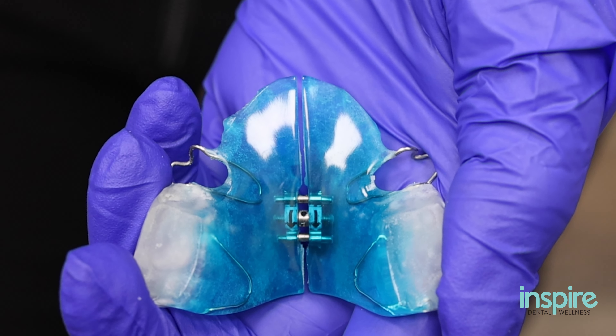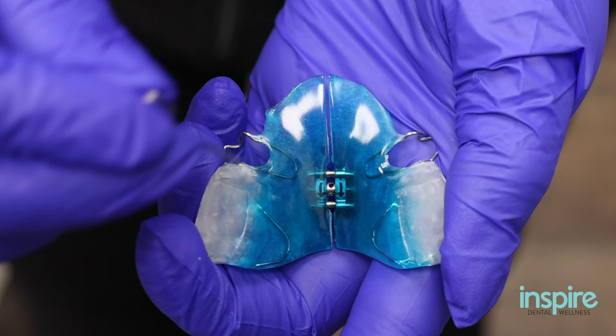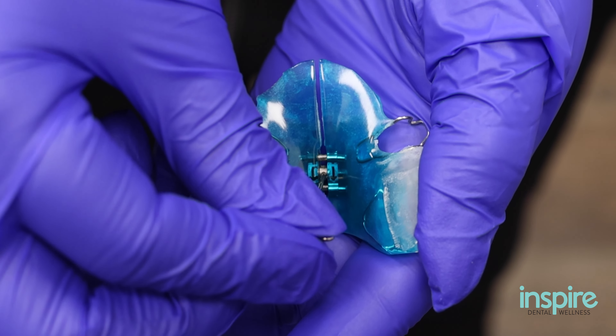You're going to turn every Sunday and Wednesday and you're going to pick up from where you left off. So now a new keyhole emerges at the top. You'll place the key in the top hole, turn down 45 degrees.